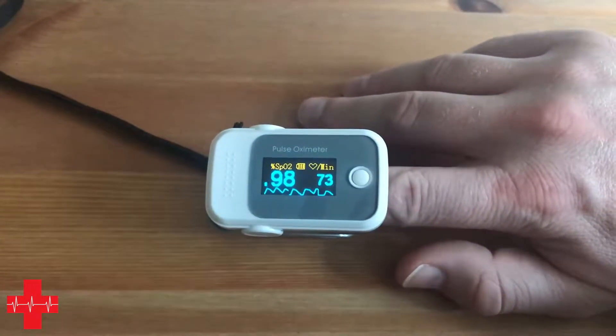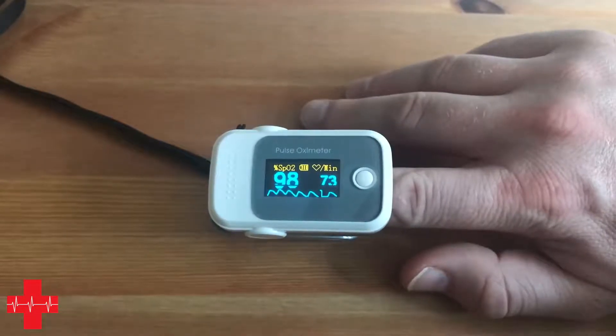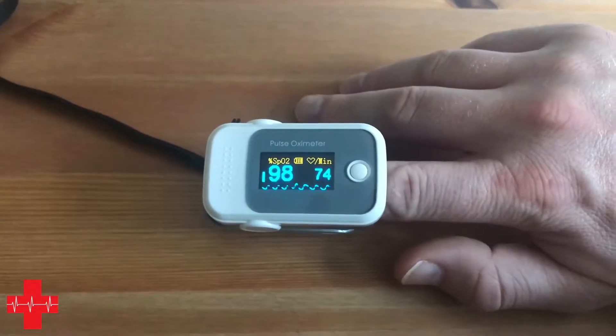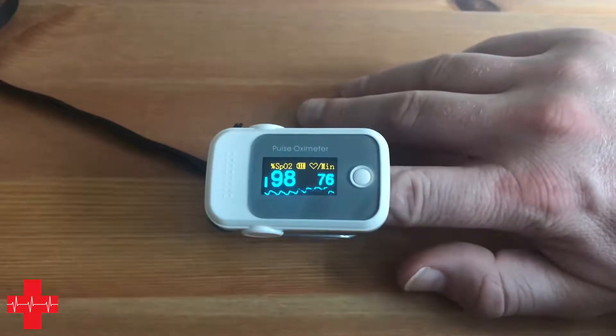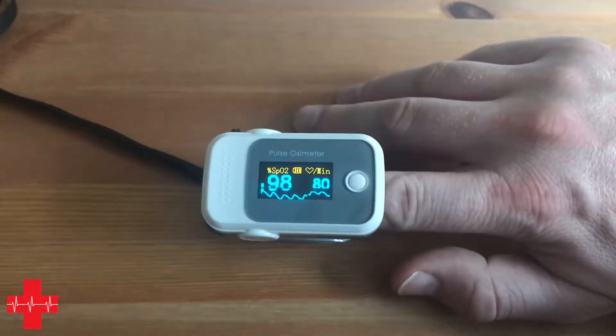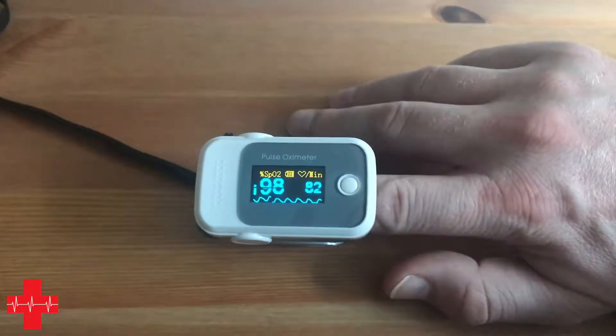Fingertip pulse oximetry and pulse oximetry in general is a very good diagnostic tool to aid in your assessment and diagnostics of a patient. And of course when you decide to apply oxygen to a medical patient following British Thoracic Society or other guidelines, you need pulse oximetry in order to make that decision.